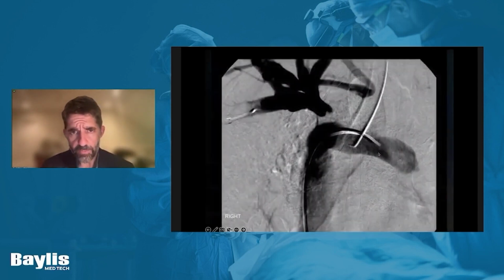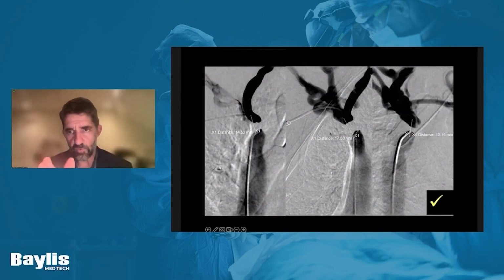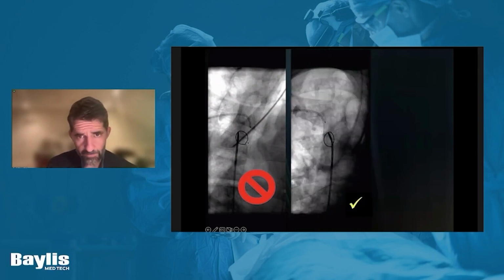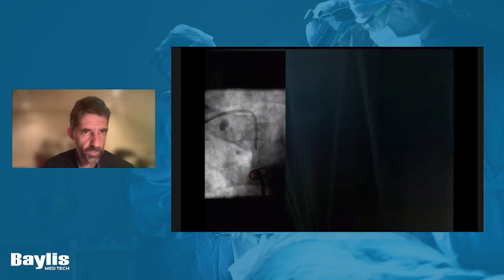We immediately detected that, as you can see here, so we pulled back the catheter. Now, yes, we are in a perfect spot. You can see in 3 views, we're very much aligned. And then we're able to use the RF wire very safely. This type of alignment, with the RF wire almost going tangential to the snare, is not acceptable. This is a pretty good alignment, and this is an excellent alignment. But the 3 views, AP, 30 degrees RAO, and 30 degrees LAO, have to be aligned.